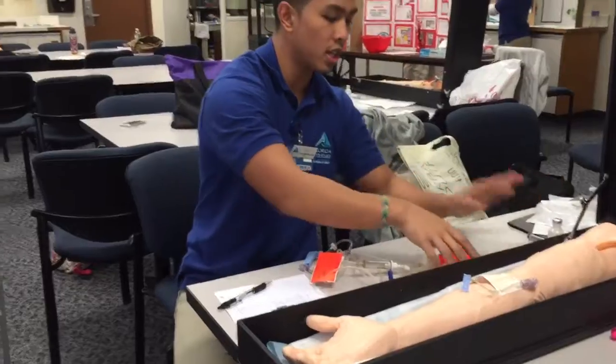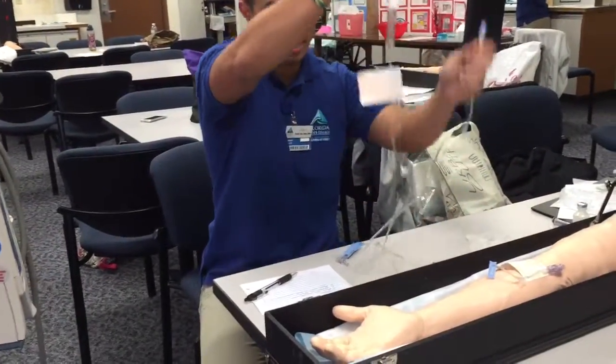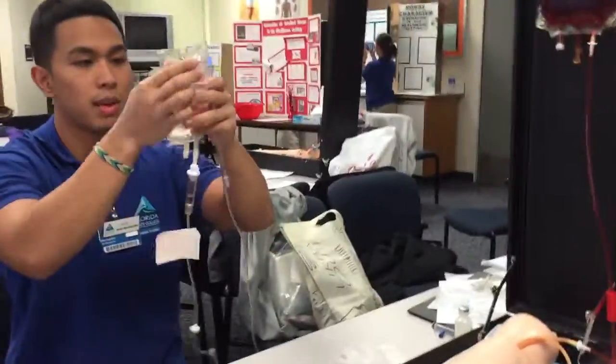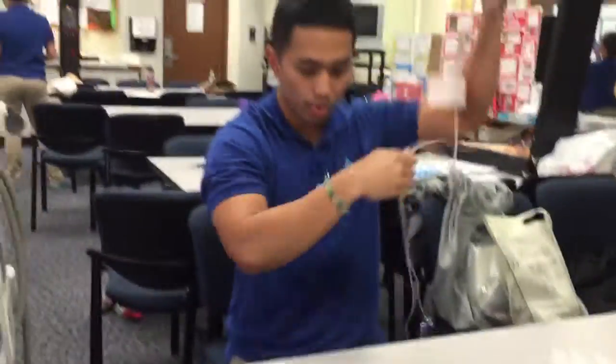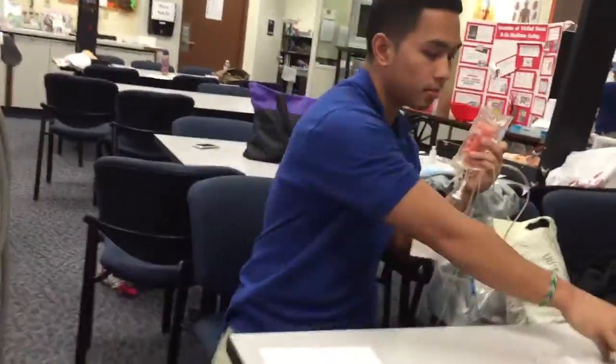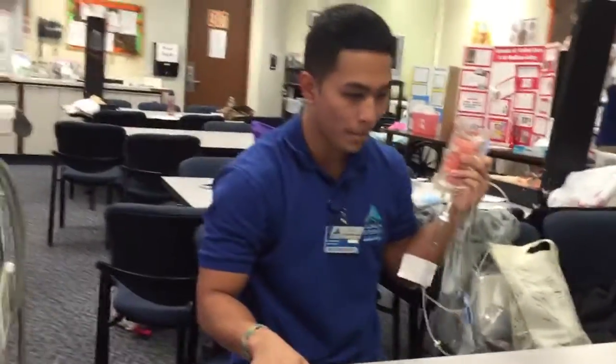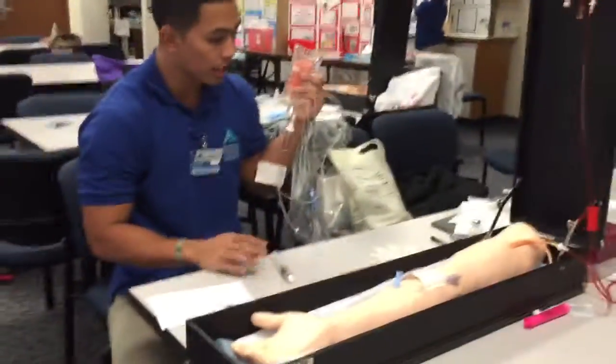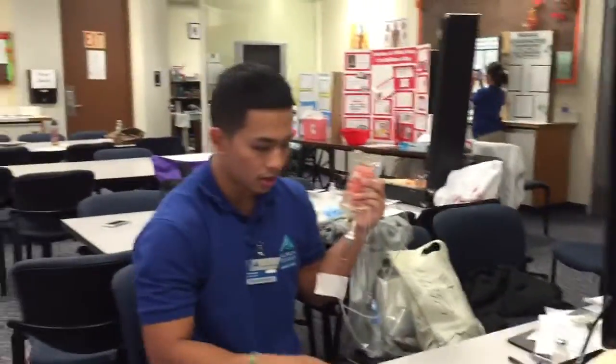I'm going to dispose of all the unneeded supplies that I have right there that I've already used. So I have my gloves, my medication, mini bag, tubing, my doctor's orders. So I believe I am ready to go in the room. And I also have, that's good, okay.